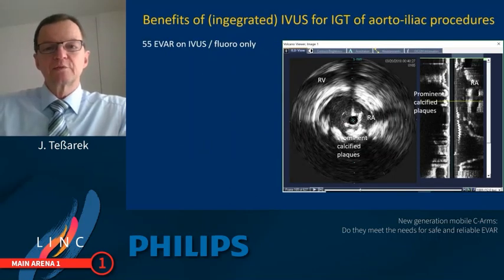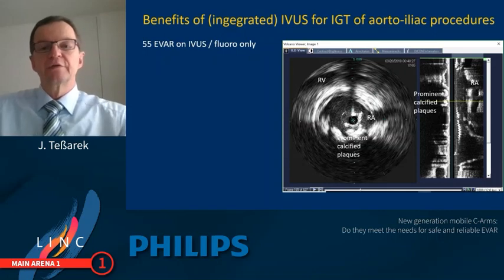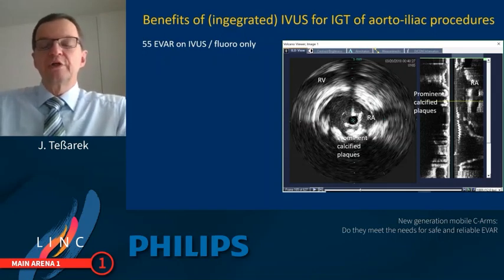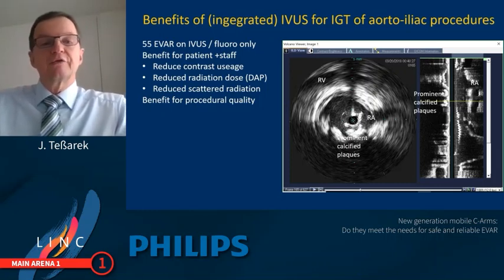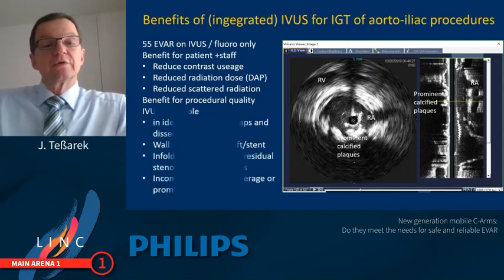One thing that has to be highlighted is the integration of IVUS, because we have been doing IVUS guided EVAR with the Allura for a long time. And in 55 completely IVUS guided procedures with fluoroscopy only, we could see there is no use of contrast. There is a significant reduction of radiation dose and of scattered radiation. So this is a benefit for the procedural quality.